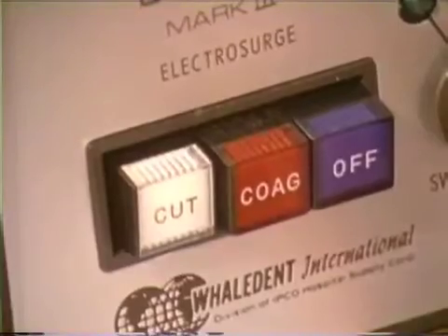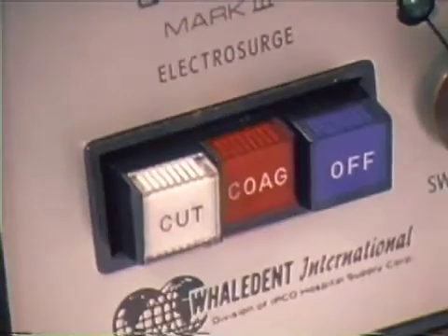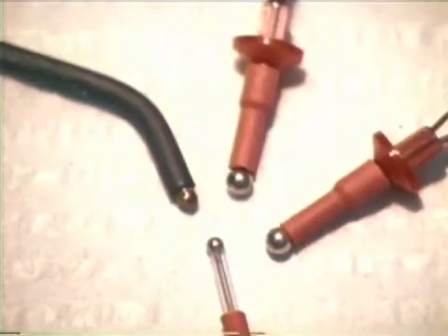The coagulate switch is located adjacent to the cut switch. Coagulation electrodes are used to occlude the lumen of hemorrhaging vessels. Various sizes of ball electrodes used specifically for coagulation are shown.